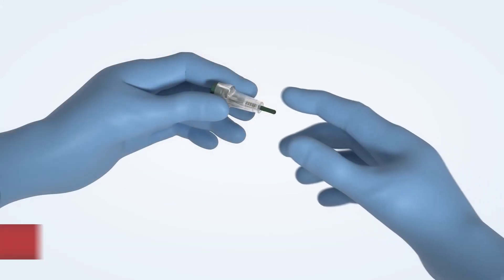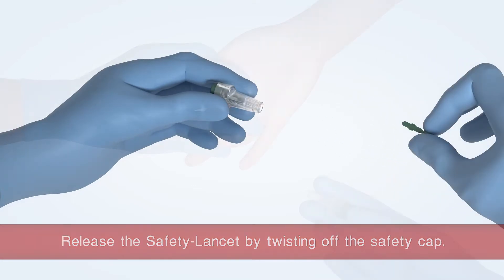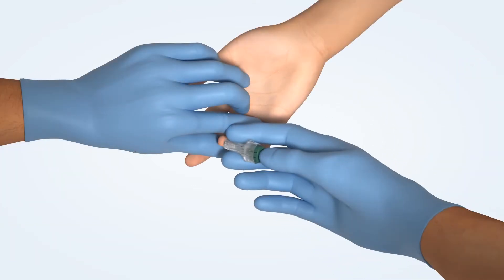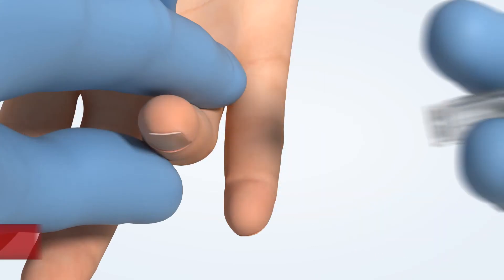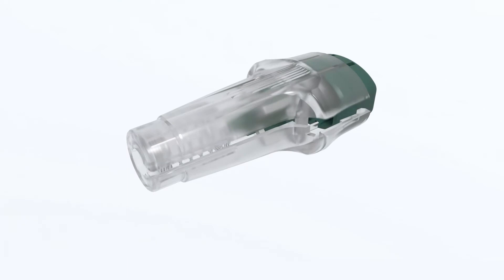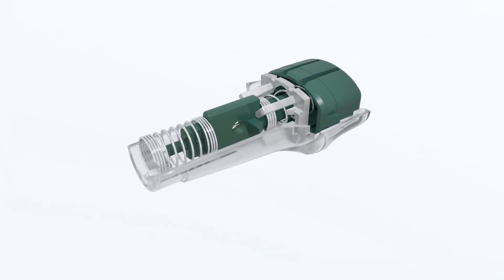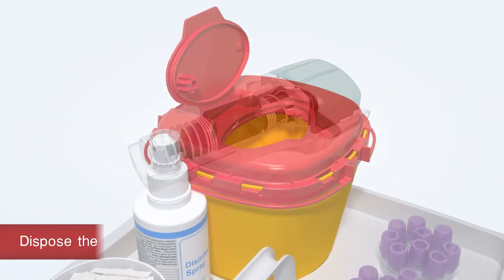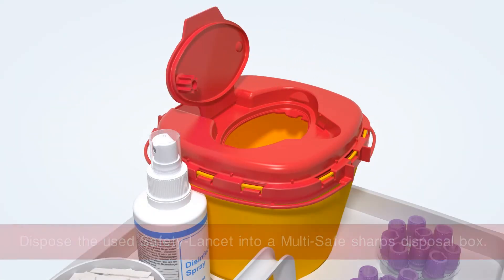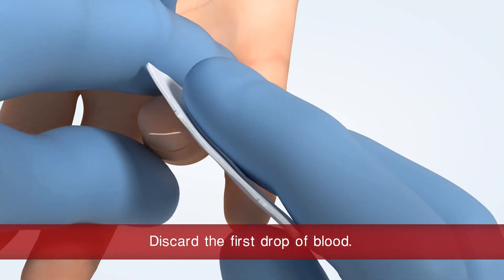Take the safety lancet and twist off the safety cap. Dispose the used safety lancet into a multi-safe sharps disposal box. Use a swab and discard the first drop of blood.